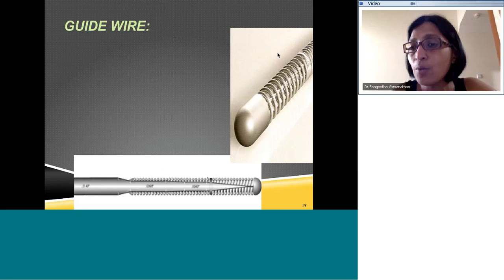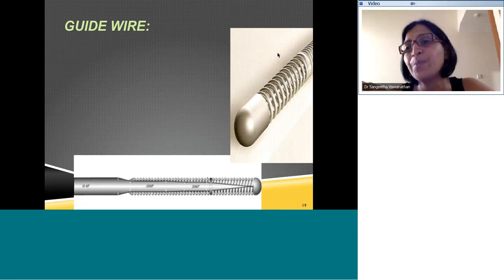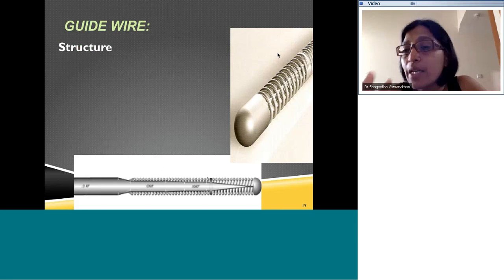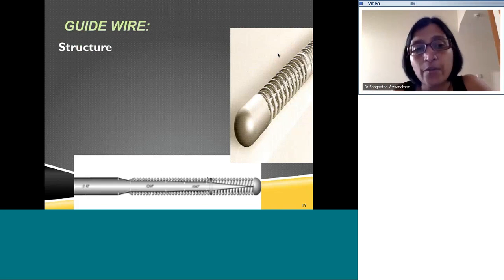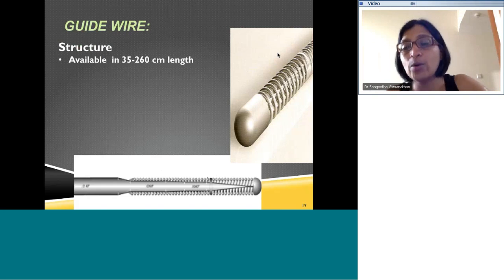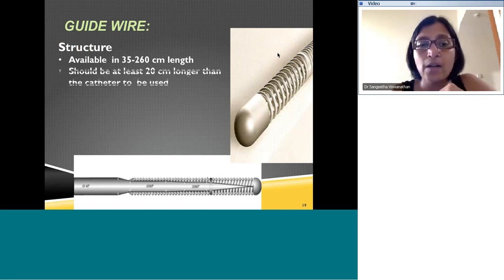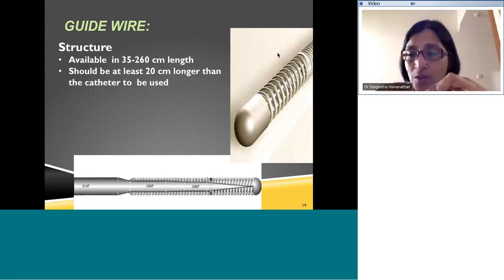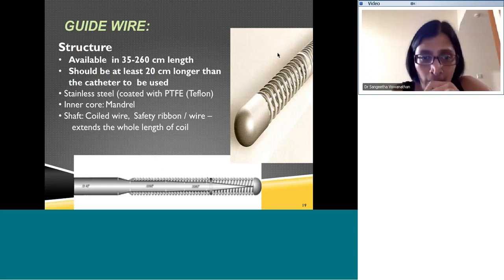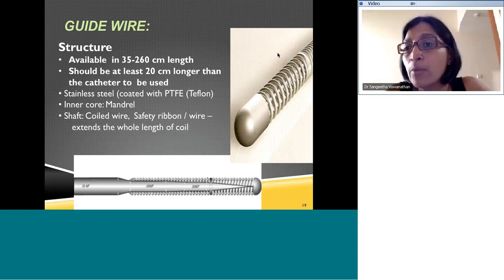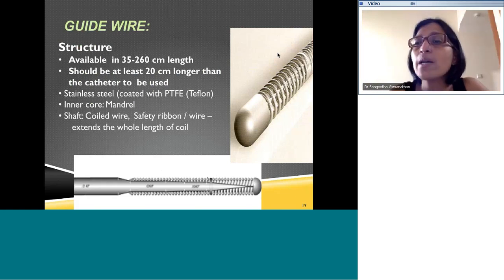If you look at the structure of a guide wire, it has a core or mandrel, and over that a coil layer that extends throughout the length of the wire. If you examine a standard wire closely, you'll notice that it's actually coiled — there's a coiled layer on the surface. The wire is also coated — it can be Teflon coated, or coated with a hydrophilic material like Terumo. These wires have to be dipped in water to make them easy to use. The tip is atraumatic — it has a bead soldered on at the end, making it atraumatic so it doesn't pierce through structures. When we reuse wires, we have to be careful that they are still intact and in good condition.